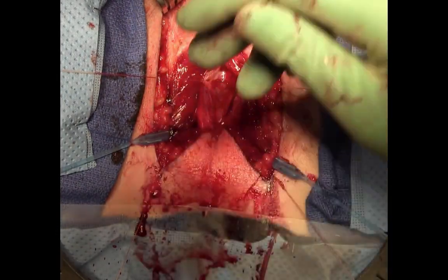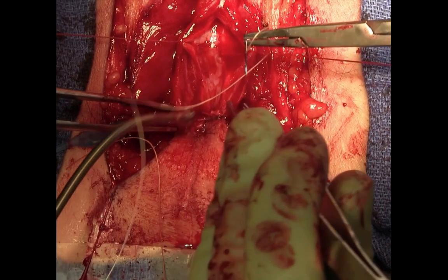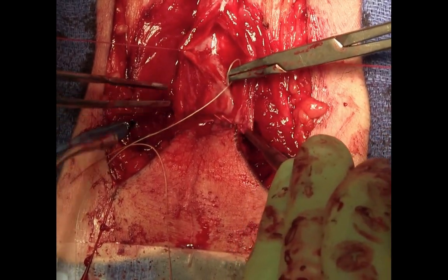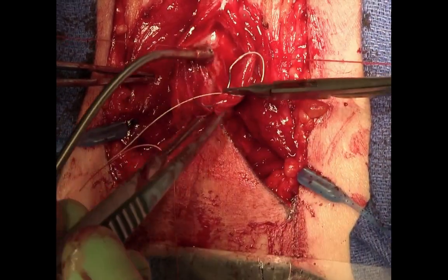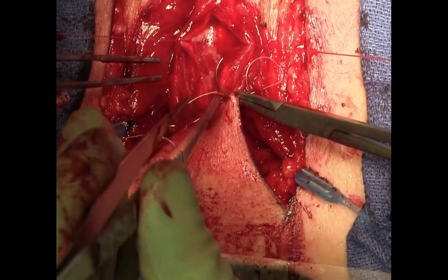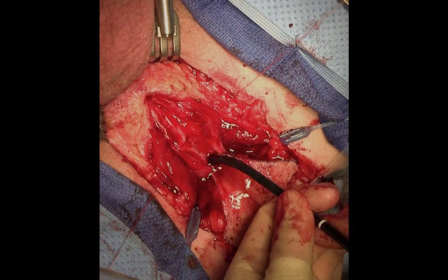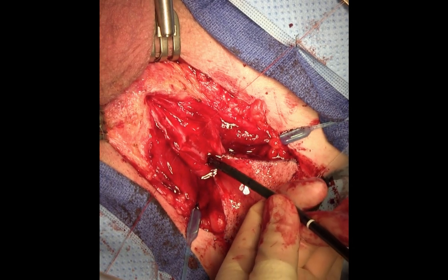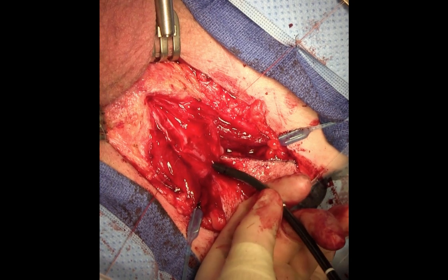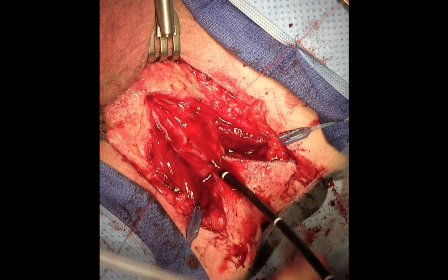After the three sutures have been tied in place at the apex of the advancement flap and the proximal urethrotomy, be very careful to probe with a bougie dilator to make sure that the opening at the proximal urethrotomy is wide enough. Additional sutures are used to advance the flap around the proximal urethrotomy. Cystoscopy is important to perform to make sure that you've gone beyond the proximal aspect of the stricture, to look for stones and bladder tumors.